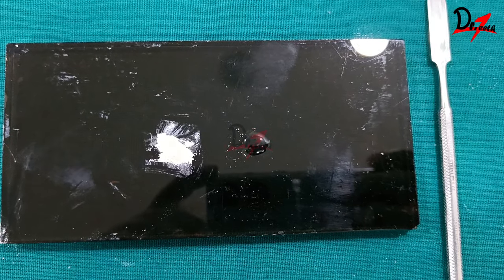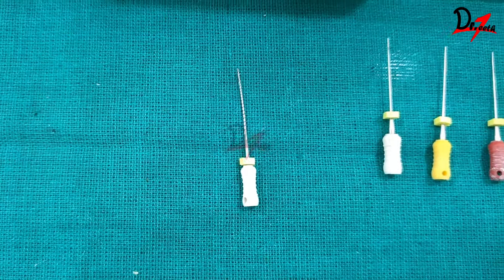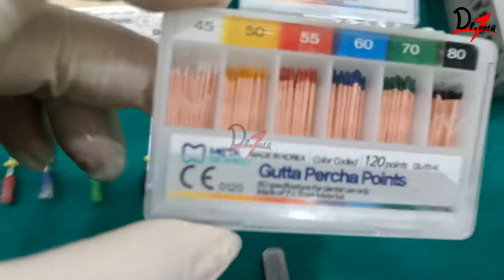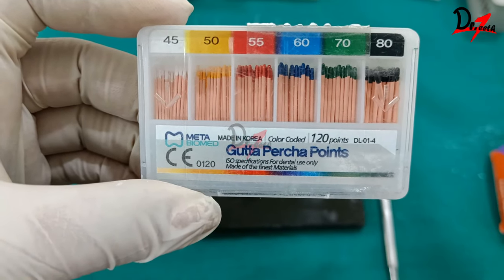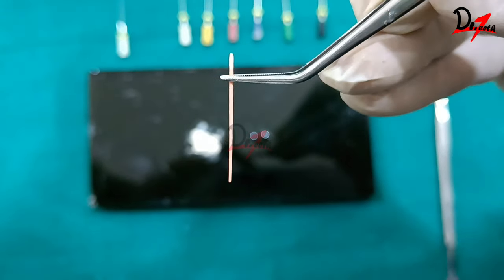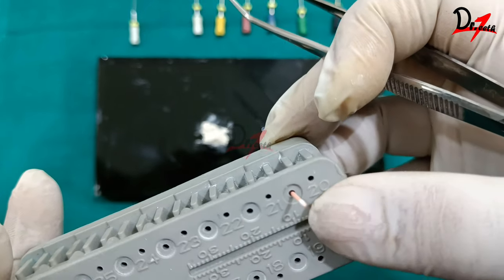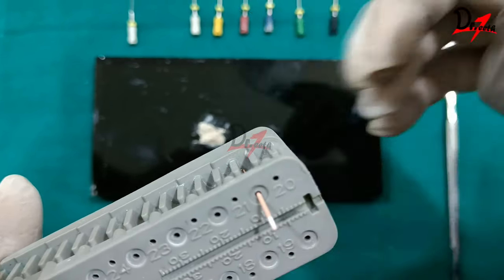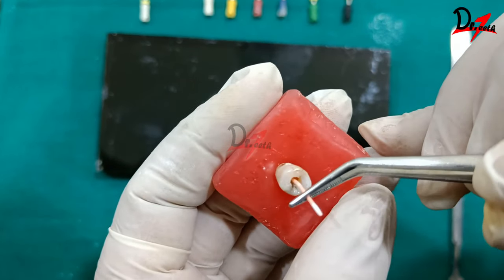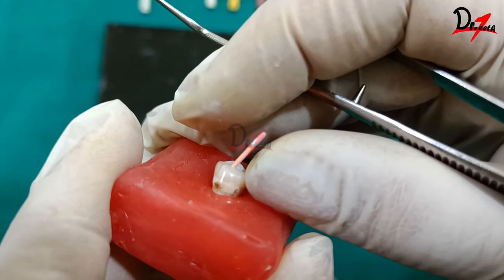I'll now dispense the powder and liquid of endomethazone sealer onto the glass slab. Before mixing, we select the master apical gutta-percha cone. My master apical file was #45 and working length was 20.5 mm, so I'll take a #45 GP cone, mark it at 20.5 mm, bend it at that point, and place it into the tooth.